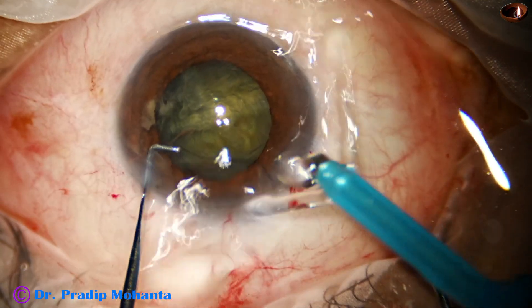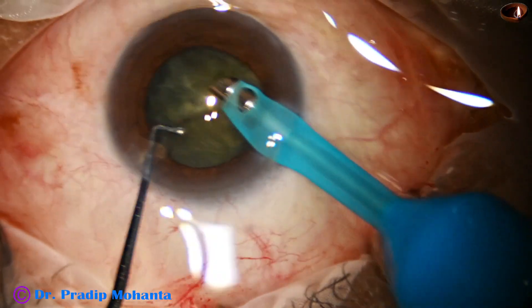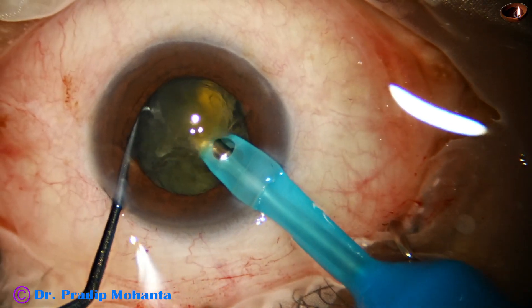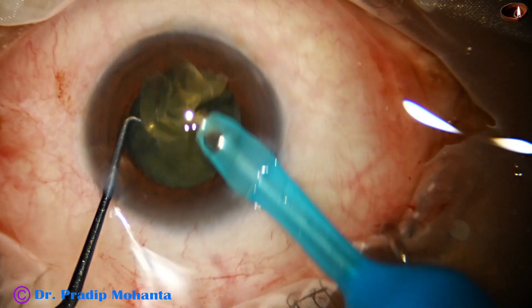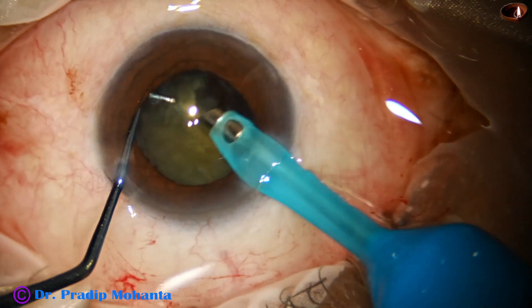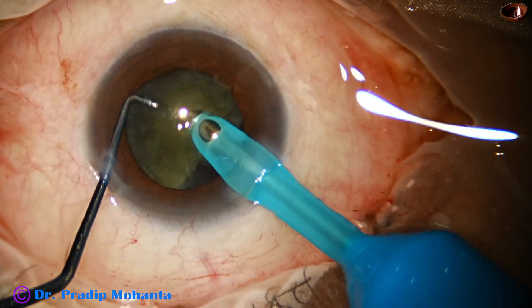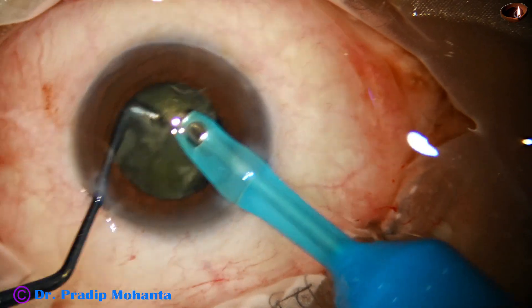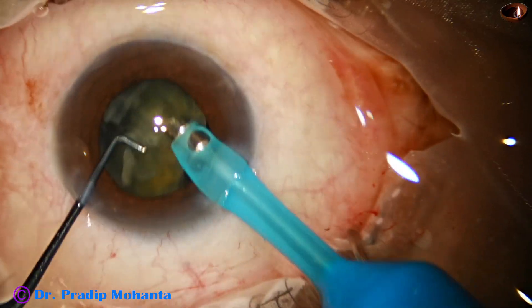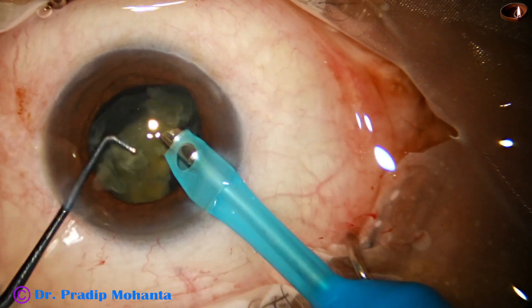Now we just have to go and emulsify the pieces. What happens in such cataracts with mid-dilated pupil is, as we try to pre-chop, direct chop, or whatever we want to do in the anterior chamber, the pupil becomes small sometimes. So, if we pre-chop the nucleus in such cases, we can easily manage the nucleus before the pupil becomes small. That is the advantage. So, in mid-dilated pupil, if the cataract is not very hard, it is a good idea to use a pre-chopper.